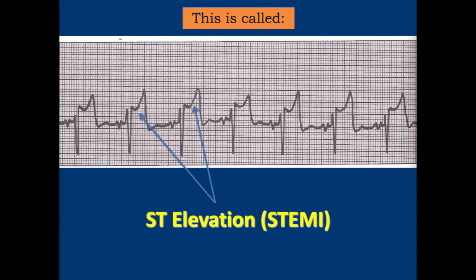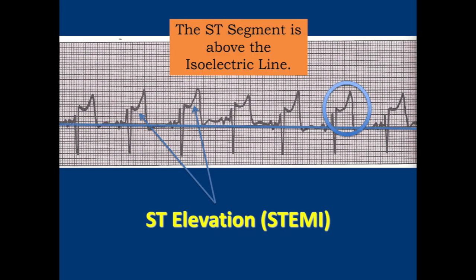Notice here that we have quite a large ST elevation, away from the isoelectric line. So this is a person having a STEMI heart attack, ST elevated MI or ST elevated myocardial infarction. You can see that ST segment is way above isoelectric.